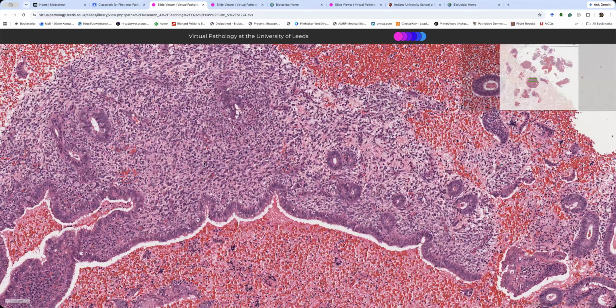So what are my rules in looking for endometritis? Clinical suspicion. Look for streaming of the cells that is kind of out of keeping with the normal expectation of the menstrual cycle. And then look for plasma cells, but you don't have to go at 40 times after everything. Practice looking for plasma cells at 10 times. And we can see here that this is good proliferative phase endometrium, because of the endometrial stroma.